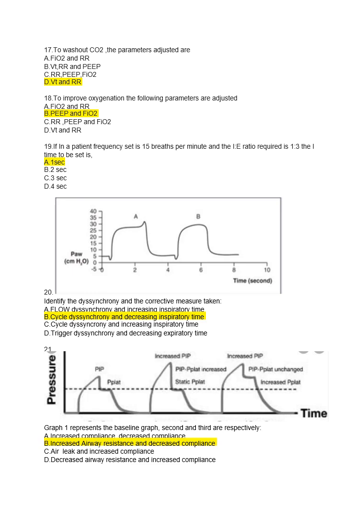So anything related to carbon dioxide washout is the tidal volume and the respiratory rate. FiO2 and PEEP have nothing to do with carbon dioxide washout. They basically deal with oxygenation. So carbon dioxide washout pertains to the ventilation part, and it depends on tidal volume and the respiratory rate or even the IE ratio.